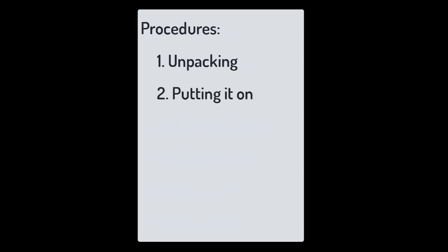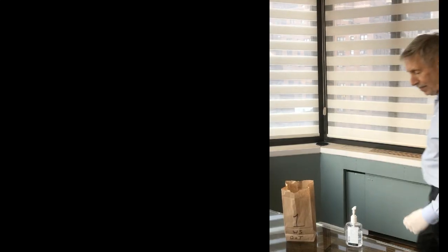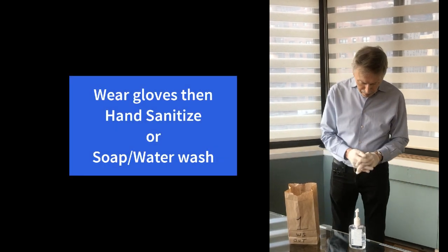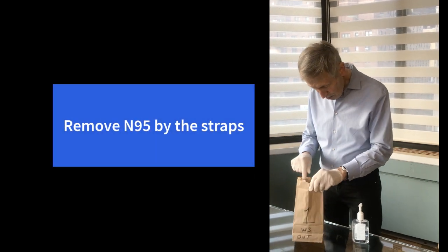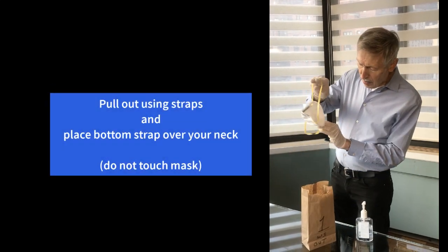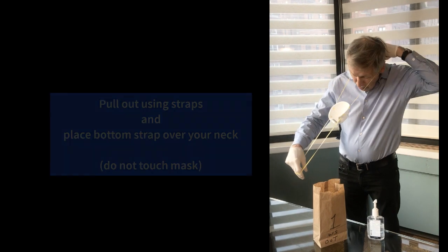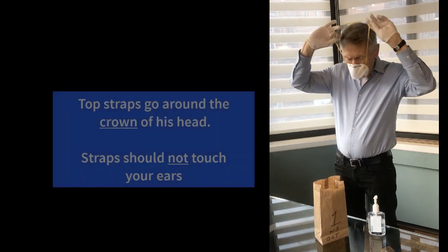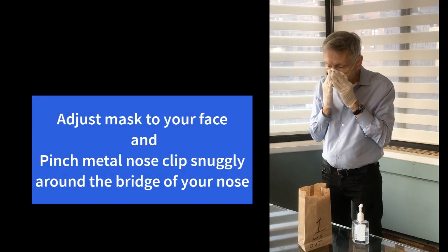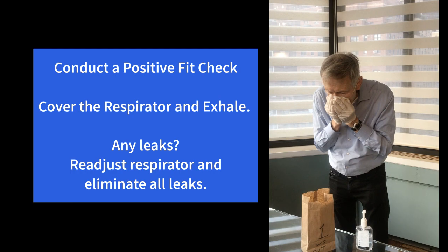Let's go over unpacking the N95, putting it on, taking a drink, taking it off, and also storing it. The first thing you'll notice is that Bill has gloves on. He'll later wash his hands or use hand sanitizer — do this for 20 seconds. Reach in and grab the N95 respirator using the straps, pull it out, and you may want to stretch the straps a little. Put the bottom strap around your neck — notice how it's not touching his head. Put the cup of the respirator into your chin and the top strap over the crown of your head. He's going to pinch the nose piece to make sure it fits, then cover the mask and blow out to see if there's any leakage, usually near the nose.